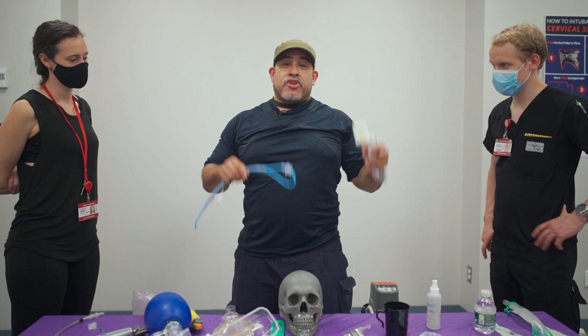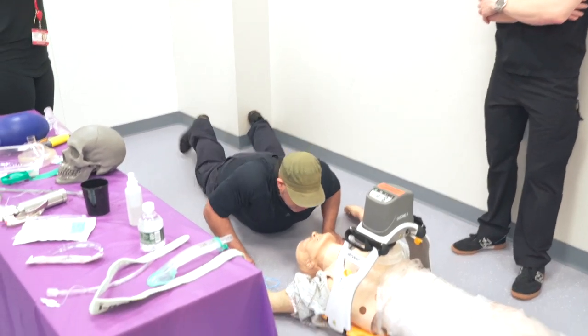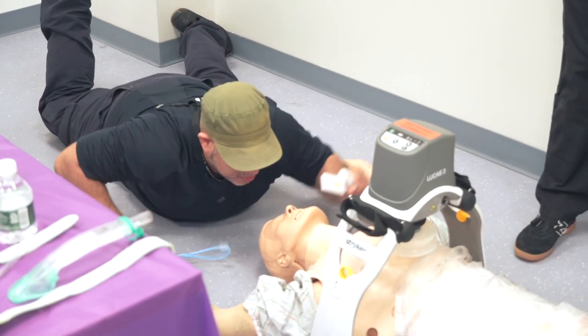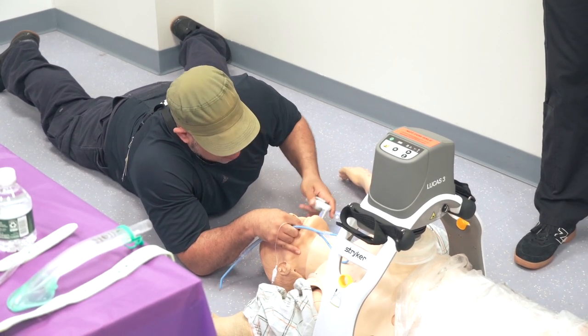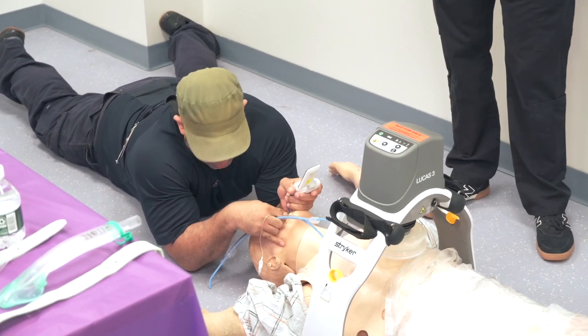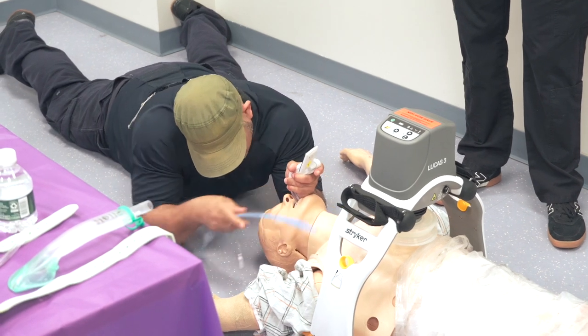When you see me on the floor, you'll understand. This technique requires me to get on the ground. I don't have to do this, but this is just to emphasize the Superman technique. Basically, I get on the ground with my belly on the ground and get the tube in. Some people will think of me as a hero for getting the tube in. It doesn't really matter. It's getting the tube in right as quick as possible.